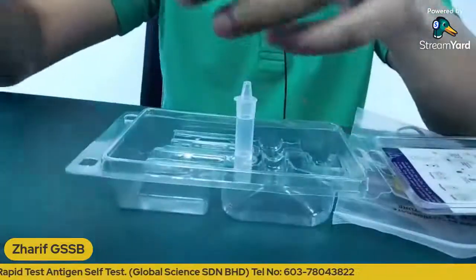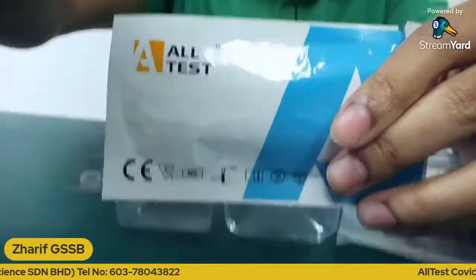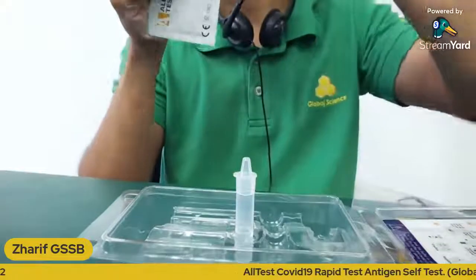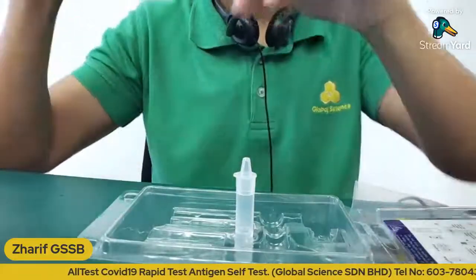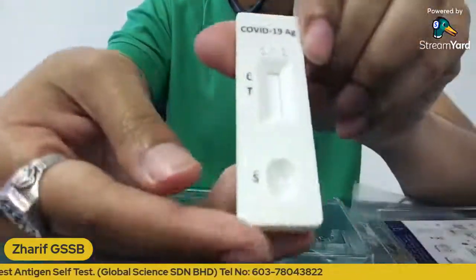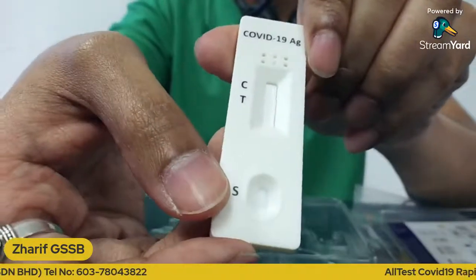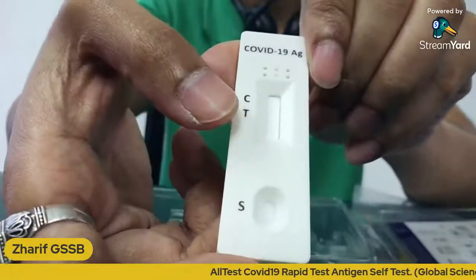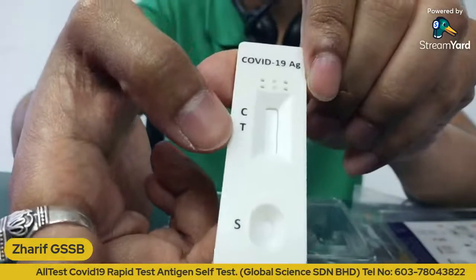And next step is to get your test device pouch. And you can just open it by tearing it. There's a mark on it, so for you to simplify it, to open it. And inside, what you get is this test device. So the S marks is where you would apply your sample. And the C stands for control line, and the T stands for test line.